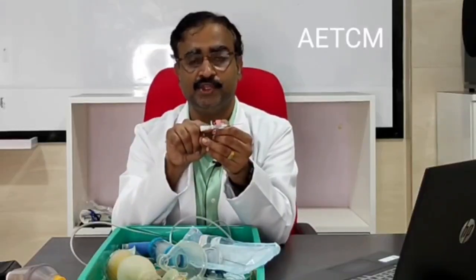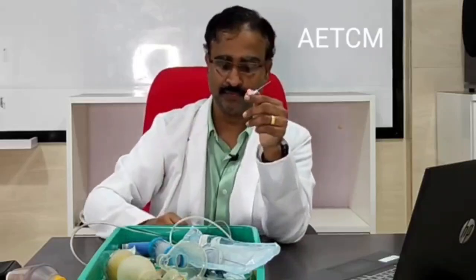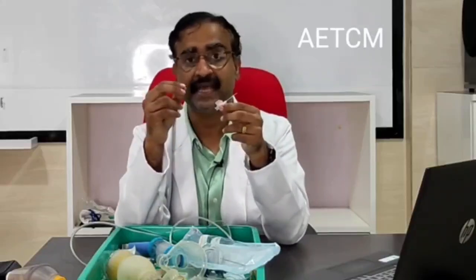Thus, we understand immediately that the cannula is in the correct position, and we need not do anything but fix it onto the part that you have inserted. So that is how an IV cannula works. The biggest advantage is that once the stylet is taken out, the sheath is completely plastic, so any movement of the wrist or any part of the body will not allow the cannula to get dislodged, unlike the scalp vein set.